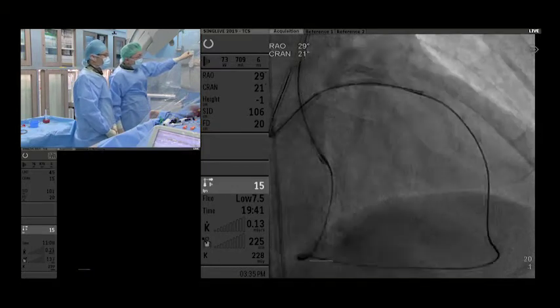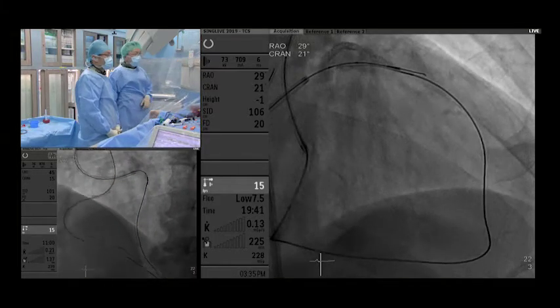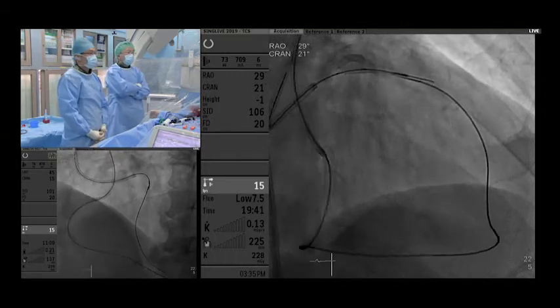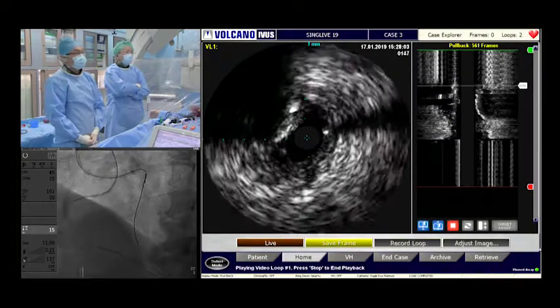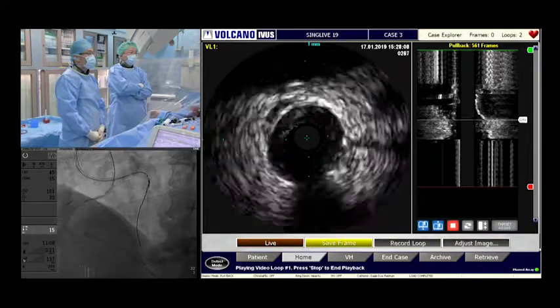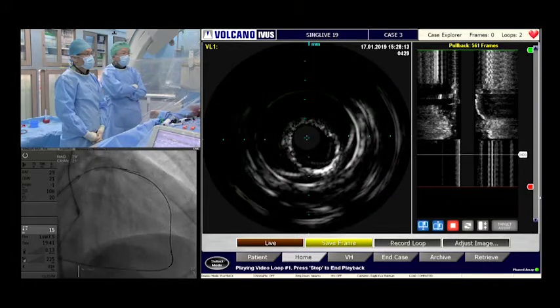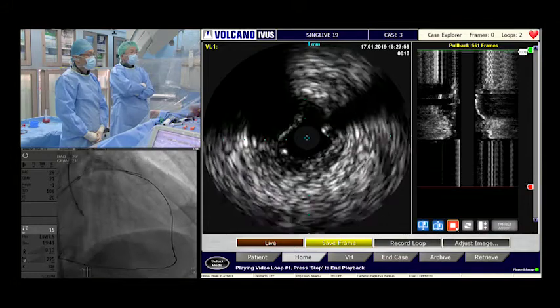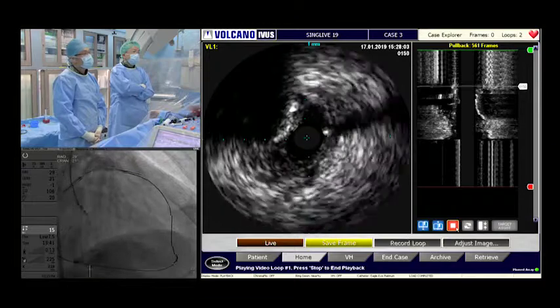So I decided to put IVUS into this occlusion. Okay, could you show IVUS? This is the pullback, the first run. No? It's the first run? Yes, this is the first run. We can see the retrograde wire is maybe in the same plane, but then it migrates into the plaque and then goes outside. So at the very distal point, I think two systems are mostly in the same plane. Yeah, I think it's a subintima.